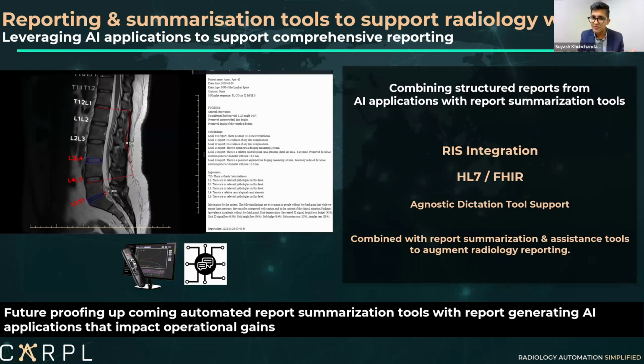While what I just mentioned was on the imaging front, there is the whole aspect about these applications now, based on the regulatory approvals, also sending in structured reports. Now, these are what truly help augment workflow because they're sending you essentially a newer starting point while reporting some of these studies.